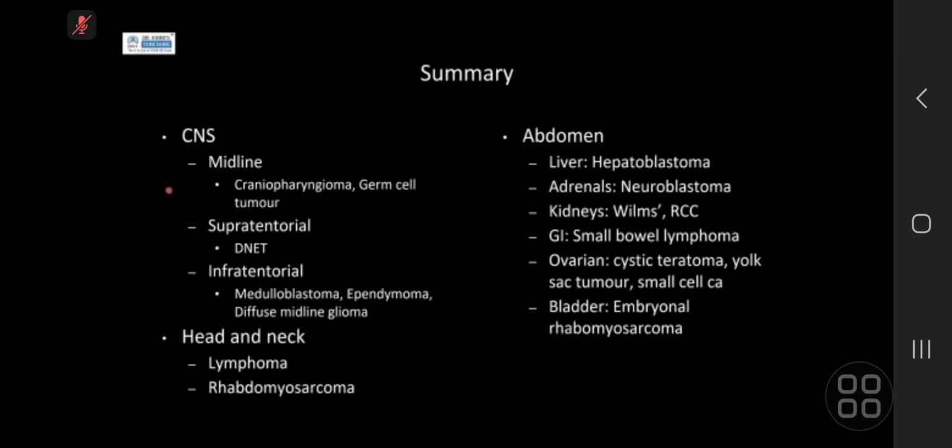So apologies, I've only just given you a general radiologist view, a general pediatric view of some tumors. So midlines, we looked at the craniopharyngioma, the germ cell tumor. Just remember the pineal calcifications, the pineoblastoma, which is quite peripheral nodular, versus your pineocytoma, which is the exploded one, and then the pineal germ cell one, which is central and engulfs it.